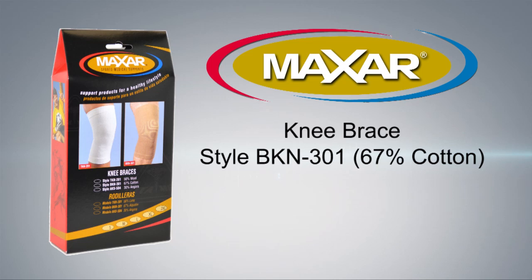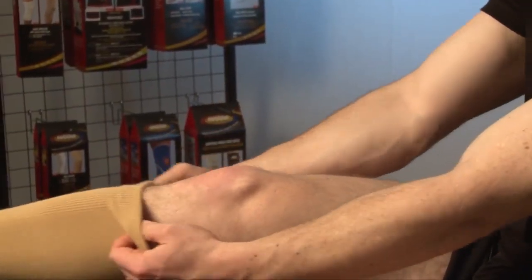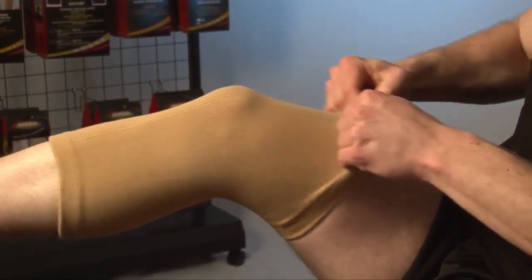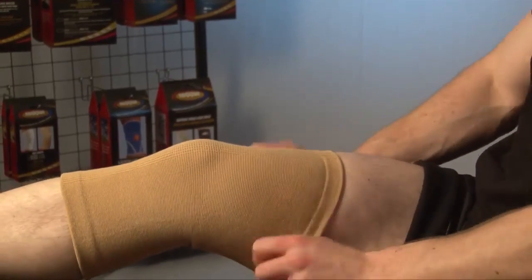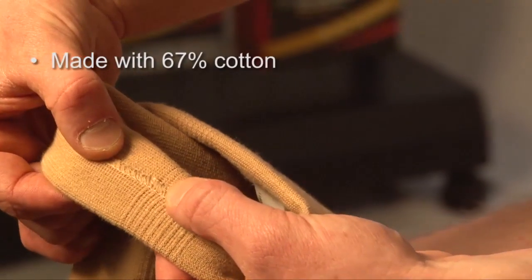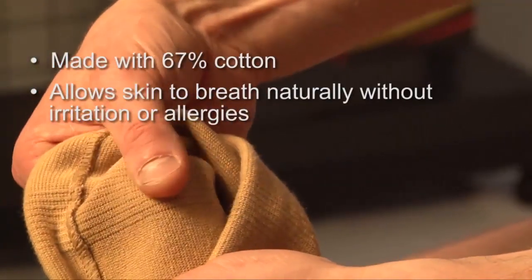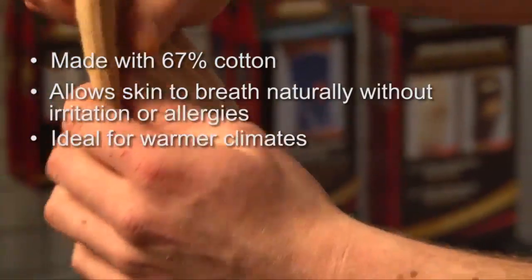The Maxar Cotton Elastic Knee Brace is designed for use when medium support and natural breathability are required. It doesn't irritate the skin and helps prevent allergies often associated with other elastic supports. Its anatomic tube shape and softness makes it comfortable to wear on a daily basis and unnoticeable under clothes. It's manufactured with 67% cotton, which allows skin to breathe naturally without irritation and allergies, and is ideal for use in warmer climates.